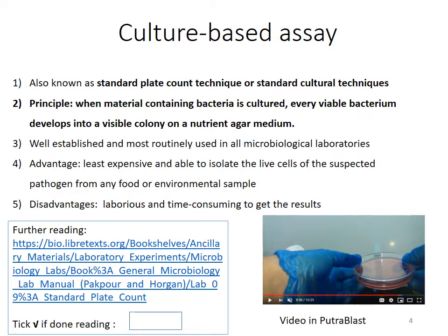The advantage is that it is least expensive, it is easy, and you are able to isolate the live cells of the pathogen that you want. For example, if you want to test for Salmonella, you can use the culture-based assay. The disadvantage is that it is very time consuming, so it takes time for you to get the results. There is a link for further reading on this culture-based assay, and also a video in Putra Blast related to this.